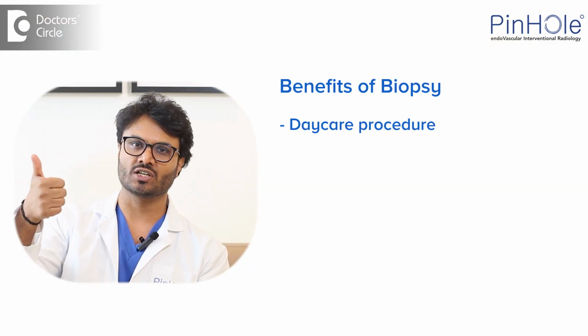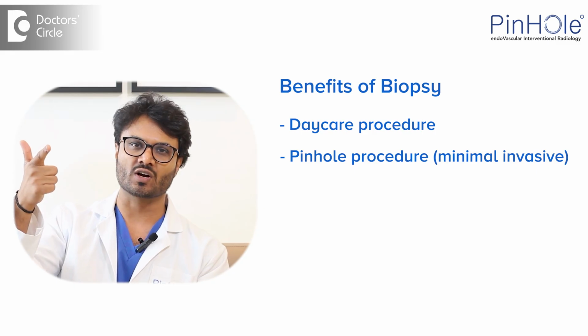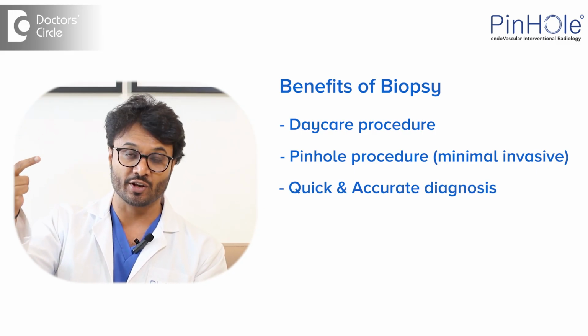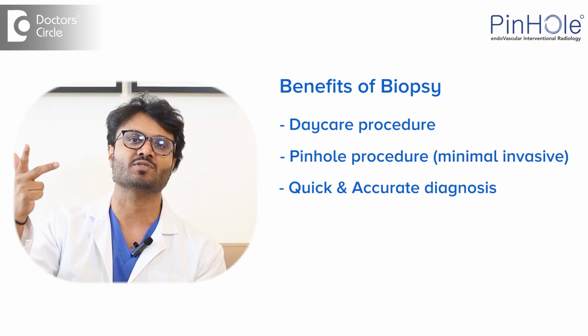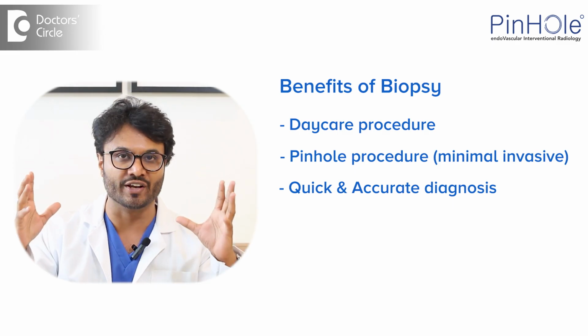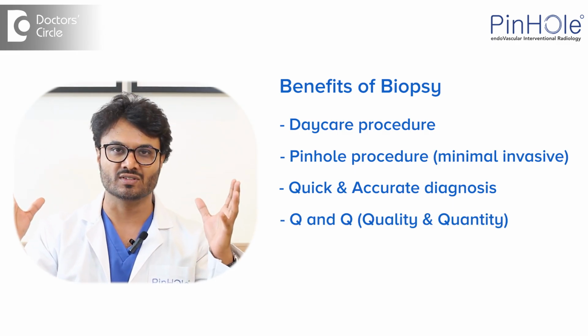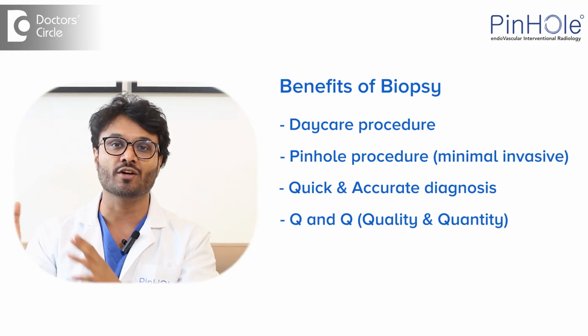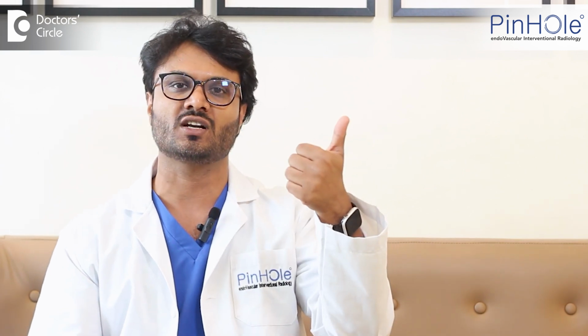Overall, in a nutshell, biopsy is a daycare procedure, a pinhole procedure, no cuts, no sutures, and it gives you more accurate diagnosis. The two important factors of this whole video are Q and Q. This is my favorite word. I mean, which is quality and quantity of tissue that we remove will help us give not only a histopathological diagnosis, but also proceed with further tests if required.